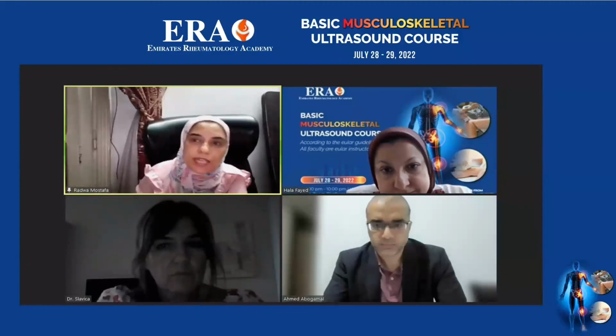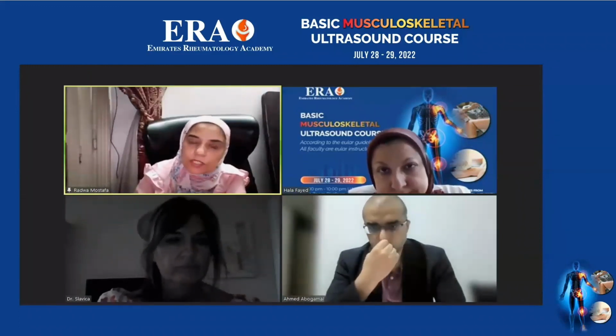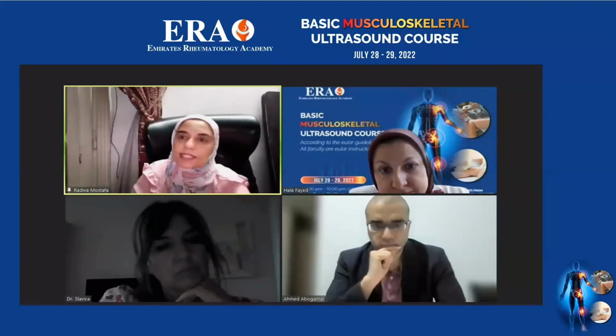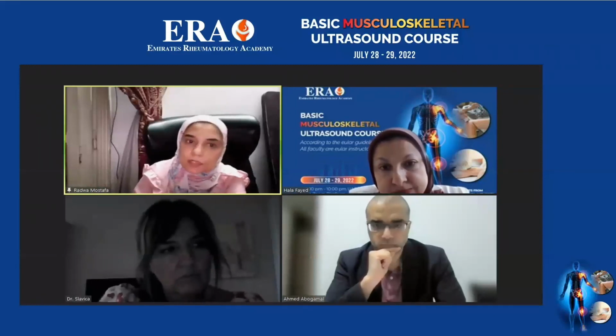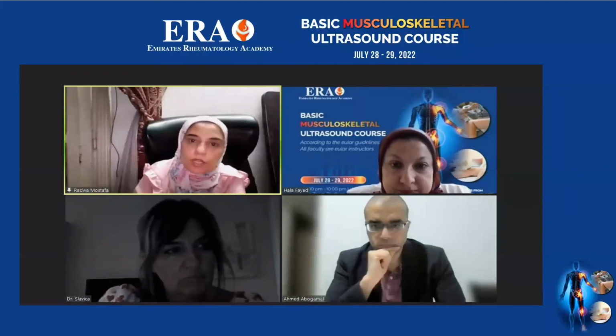We don't assess inflammatory enthesitis at one enthesis only, but we can assess the other entheses if we find more than one pathology. We don't depend on the Achilles tendon only. We can scan the patellar tendon at its proximal and distal insertion, and also the quadriceps tendon to confirm, and even in the upper limb, the triceps insertion.